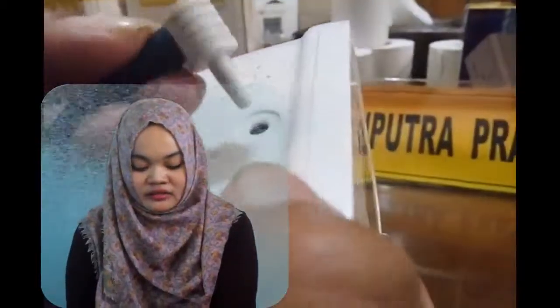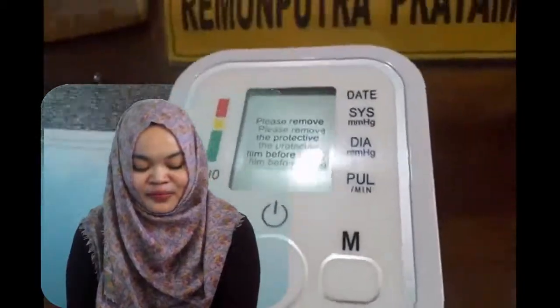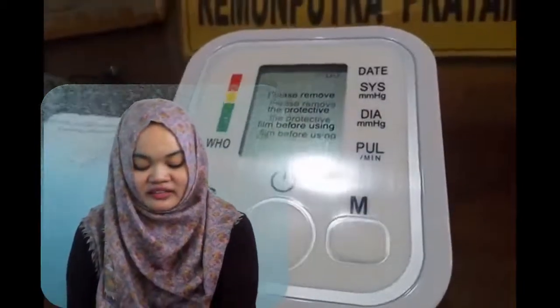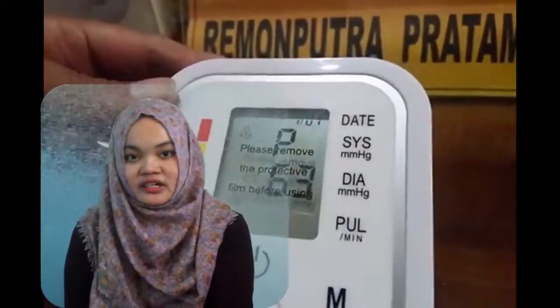Seven, press the start or stop button. Eight, the pumping will be done automatically. Nine, look at the numbers listed on the tensimeter monitor — blood pressure, heart rate.